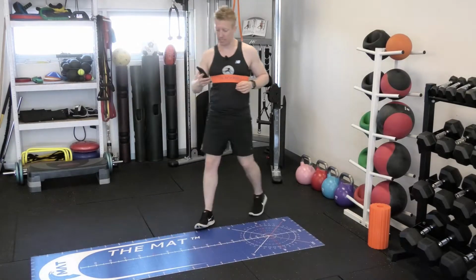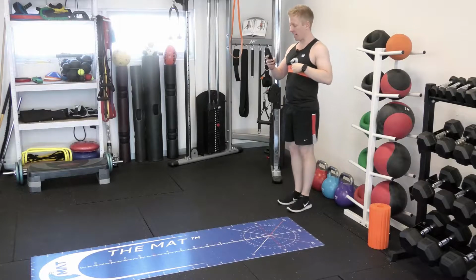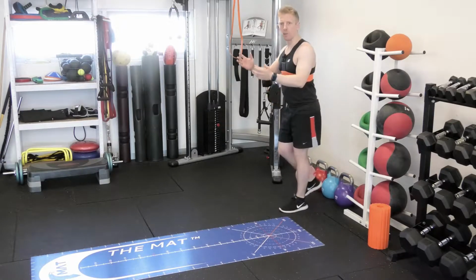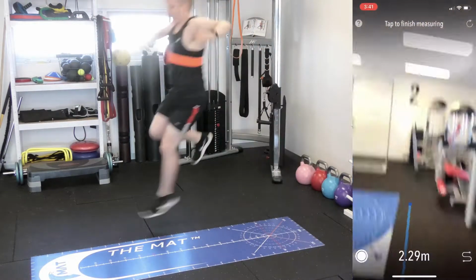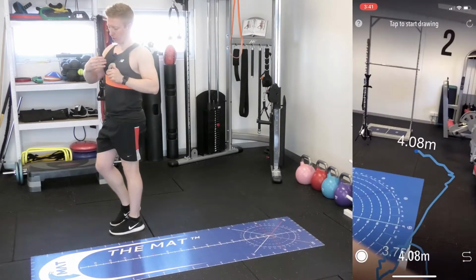So what I'm going to do is head back to the mat here and perform my hop test again. Before I do that, though, I'm going to hit the start button. I'm going to tap the screen to start drawing, and then I'm going to put it in my black roll band there. Okay? Then I'm just going to simply go ahead and perform an anterior hop. I'll then take this out and I'll tap the screen to stop.